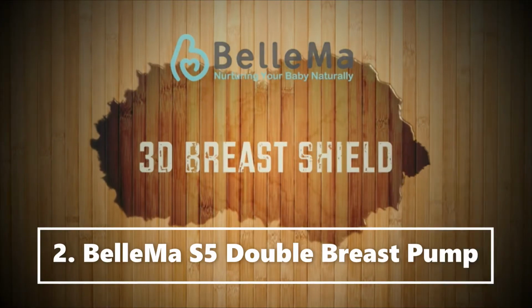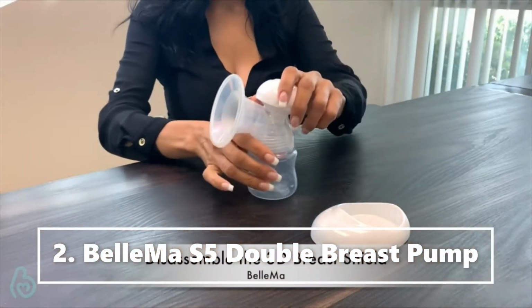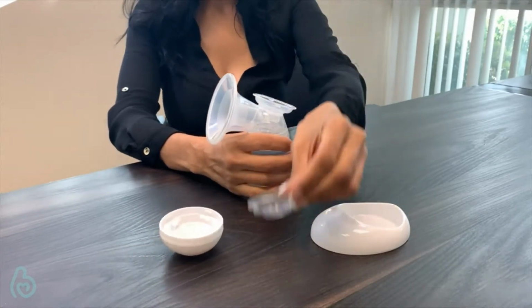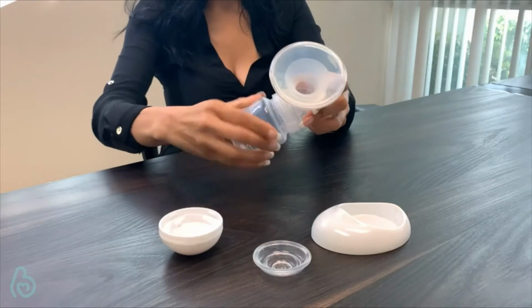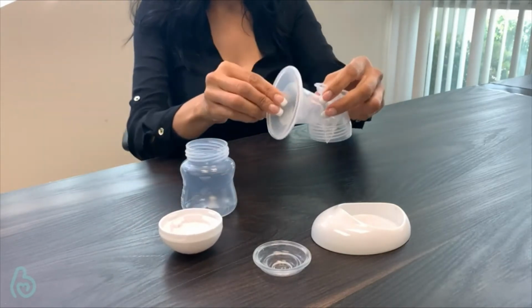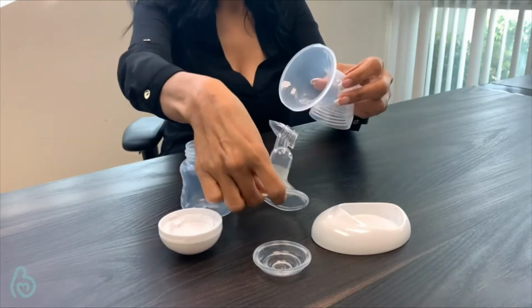Disassemble your 3D collection kit. First, unscrew cap from the breast shield body. Now remove the silicone diaphragm. Now unscrew bottle from the breast shield body. Detach the silicone cushion and remove from breast shield body.